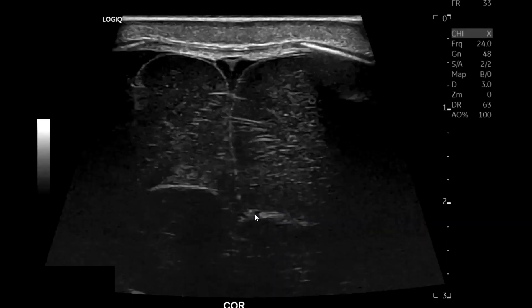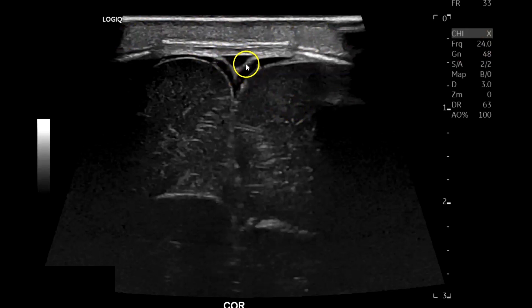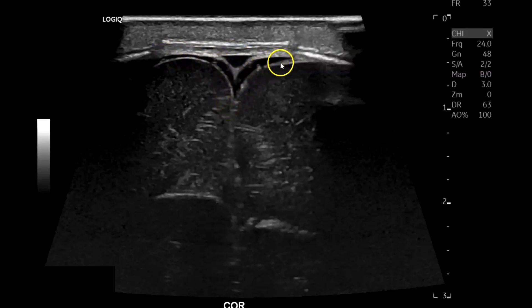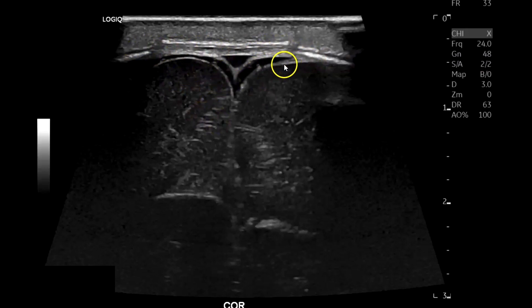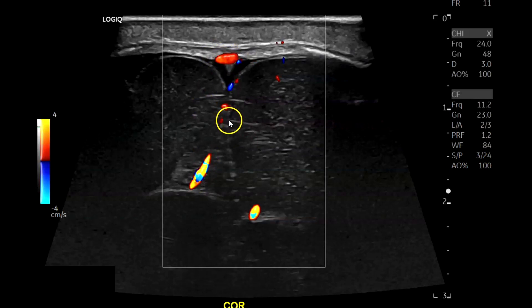Then the same thing on the left. This is with the 24 MHz transducer — the L24. Here you've got your skin, superior sagittal sinus, a thin amount of subarachnoid fluid which is normal, and then the pia mater covering the brain. The dura mater would be around here — remember: dura, arachnoid, pia. You can see the high-resolution brain — it's amazing — and with color that's the radial flow.